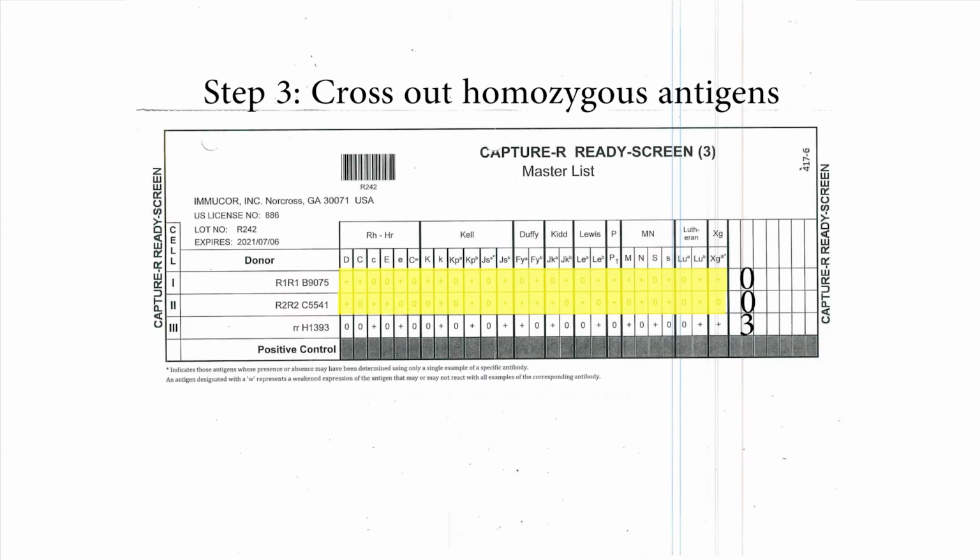Let's get back to our example today. The first antigen is D antigen. It shows a positive sign, which means that this donor has D antigen present on the RBC. There's no little d shown here, so the presence of D is homozygous, which means you can use this donor to cross out. Keep in mind, this is a simple explanation. The antigen actually has a very complicated lifestyle.